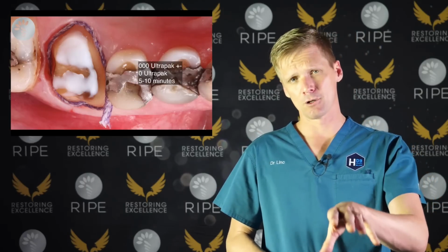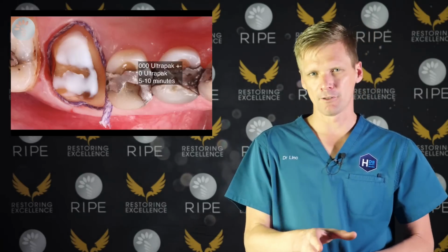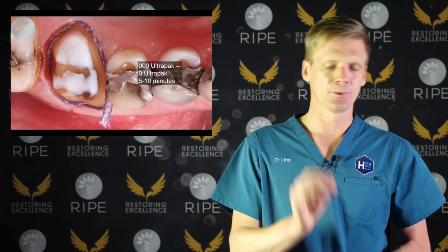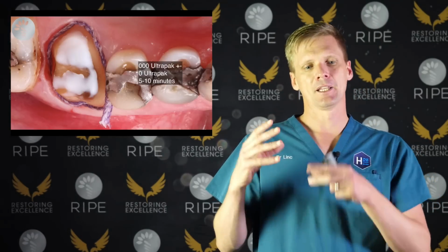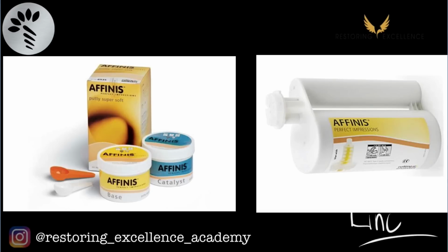I'll go through this whole case a little bit later, step by step, but this case is getting ready for the impression. So there is a 000 cord packed first, and then there's the big fat 0 cord over the top, and then I waited about 5 minutes, okay? And then you've got enough displacement for the silicone to easily go down between the gingiva and the prep.